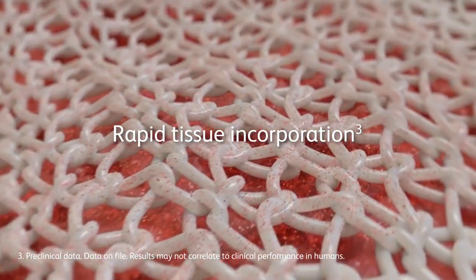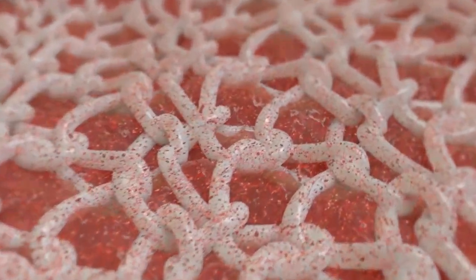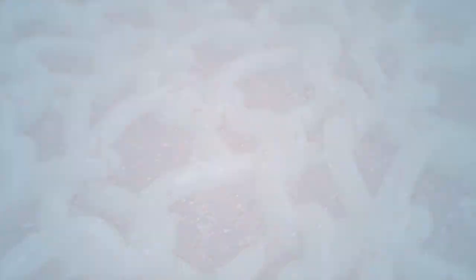As the mesh slowly and predictably resorbs, the material provides strength to support the repair site for up to 12 to 18 months as demonstrated in a porcine model.